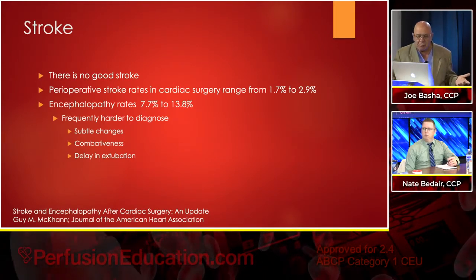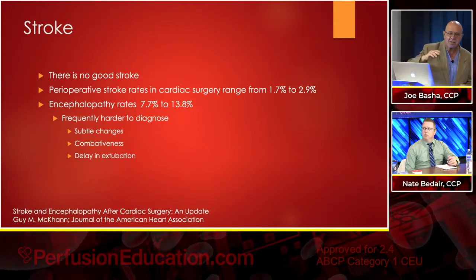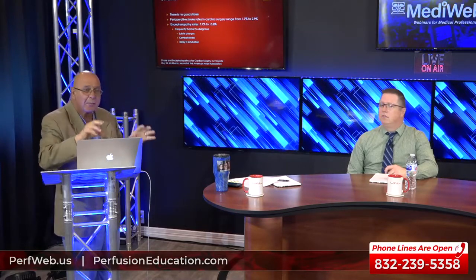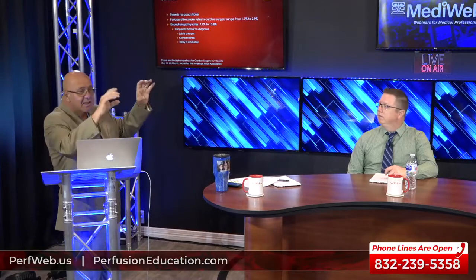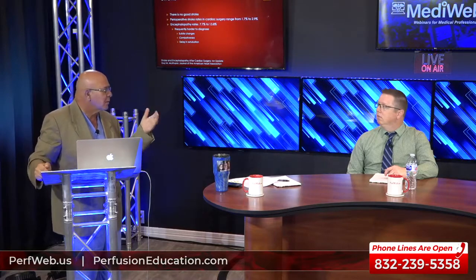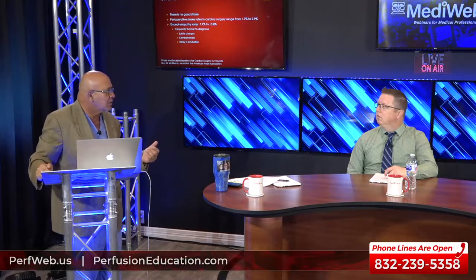I'm not going to say I don't believe in cerebral oximetry. I think it is a good device, but I think it has limitations. Okay. I think we need to recognize that it has limitations. It's not perfect. But if you make the decision to use it, and it's on the patient, and your numbers are reading, let's just say 60 and 60, and they pick the heart up to do the circ graft, and your cerebral oximeter reading on the left side goes to 25, that should raise an alarm. You should be saying something's wrong.